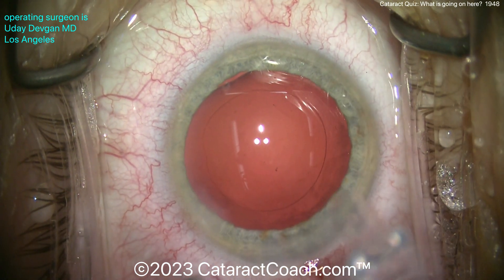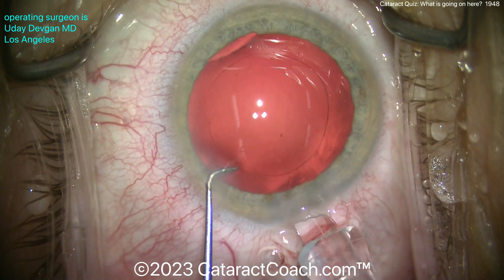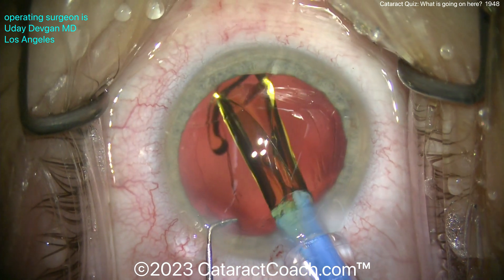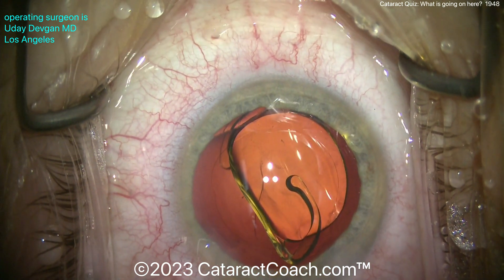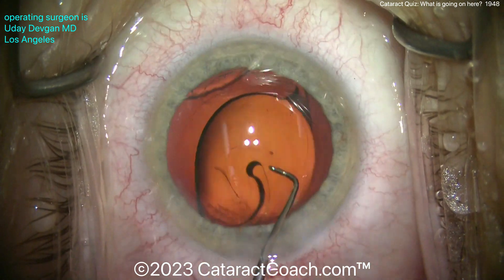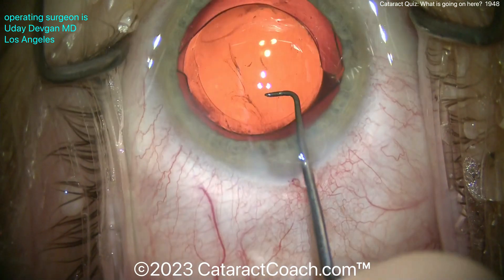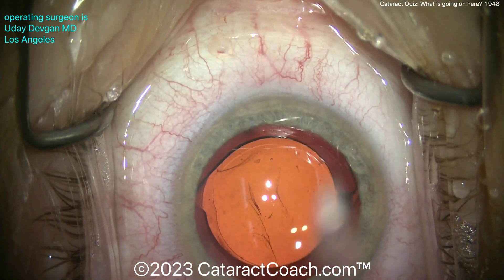Now we're able to put the lens in. We'll get that mucus strand off in a moment, and you can see everything looks normal. So this was just a false warning. I'm glad I'm always vigilant — always keeping an eye out, forgive the pun — and making sure that everything is going beautifully. You've always got to keep your guard up, look carefully, and notice any fine details. The lens is in the bag; the capsular bag is perfectly intact with good zonular support. There's that strand of mucus on the cornea, and you can see the rhexis overlaps very nicely on the optic for 360 degrees — I think we achieved that five-and-a-half millimeter rhexis.